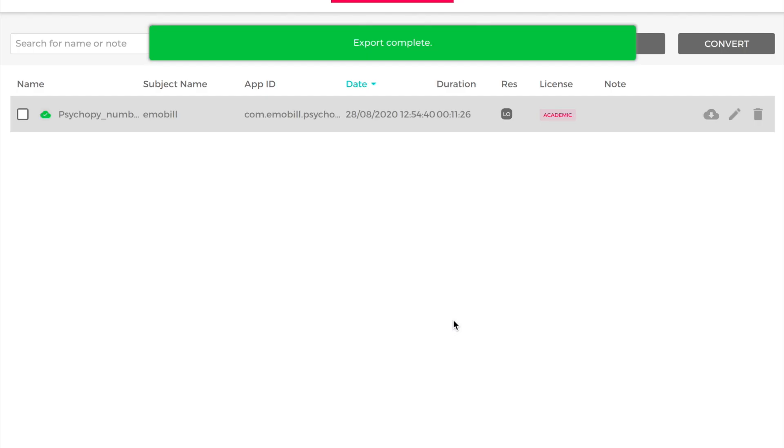Select the features you want exported and the type of file. I am going to be processing the data with Python, so I will select CSV.